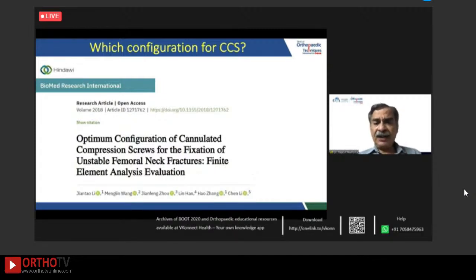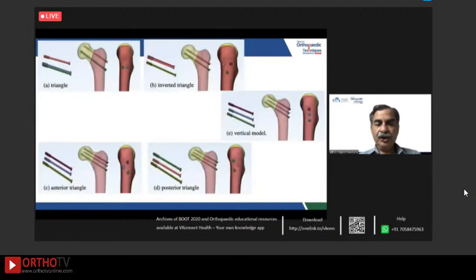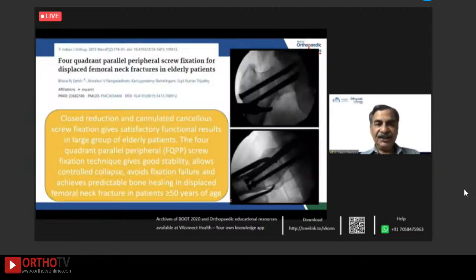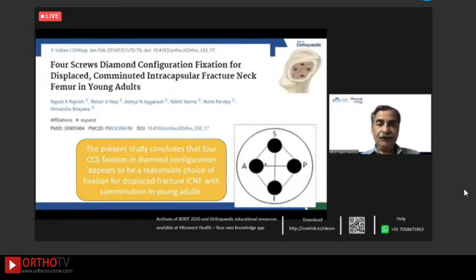So what is the optimum configuration for cannulated cancellous screws? This finite element analysis showed that an inverted triangle configuration has the least likelihood of cutting out and has the maximum mechanical advantage. In elderly patients, the 4-quadrant peripheral screw placement has been described. It's called FQPP, 4-quadrant parallel peripheral screw fixation, which gives good results in patients more than 50 years old. Whereas if you have a young patient, you can use 4 screws in a diamond configuration, and that's the choice.